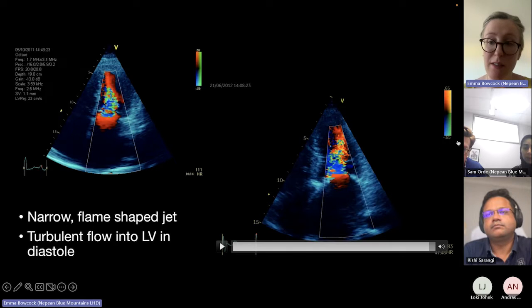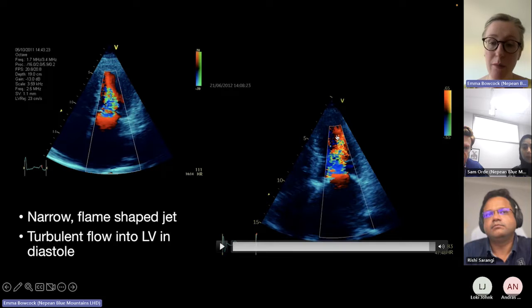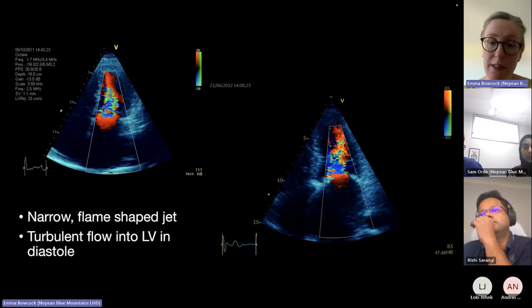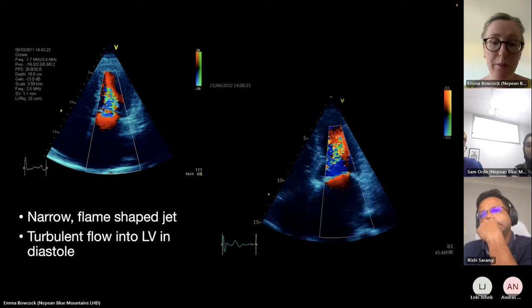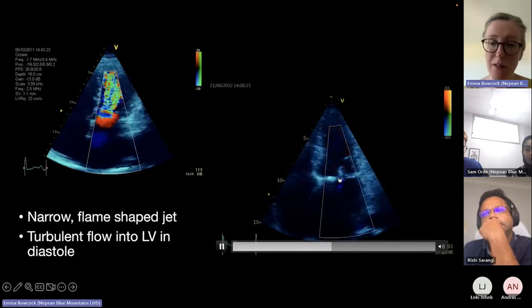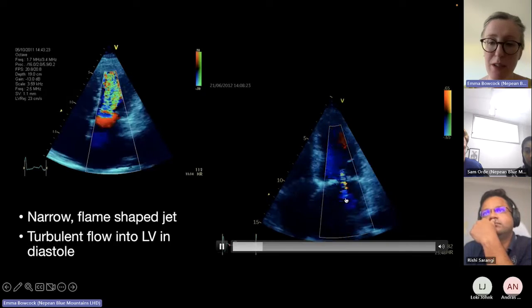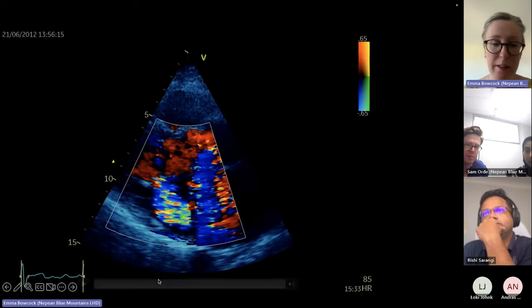But nice, the scale's optimized. Probably the color box for what you want to see is pretty good actually for mitral stenosis. You want to see that turbulent color inflow. You don't want to miss any significant regurg. You could maybe argue to make it a little bit smaller, but not too bad. So can you all see that sort of PISA on the inflow with lots of turbulence, as well as the mitral regurg jet as well?